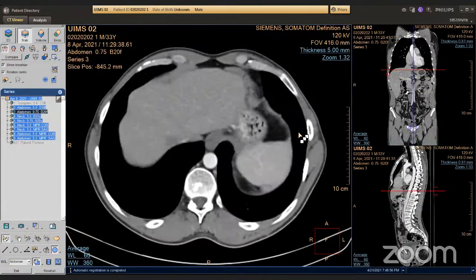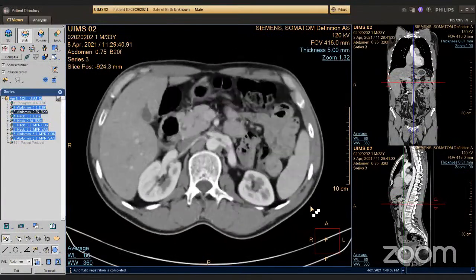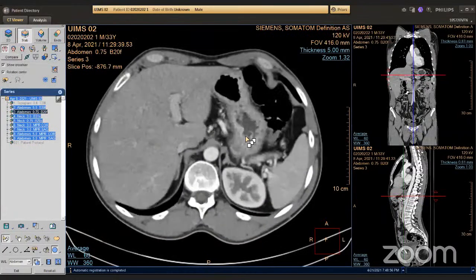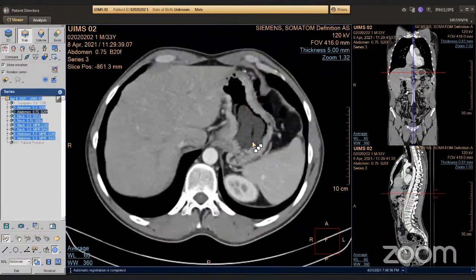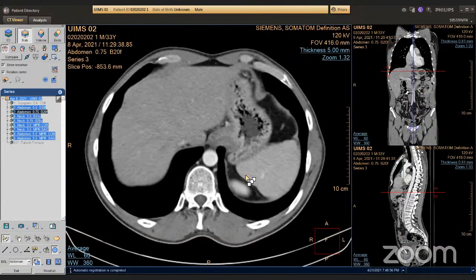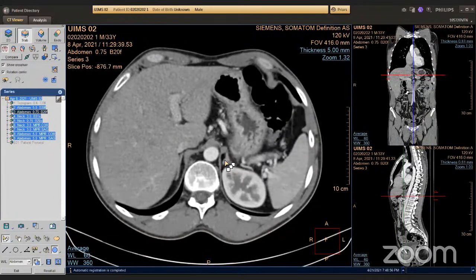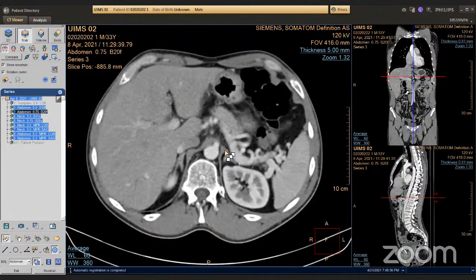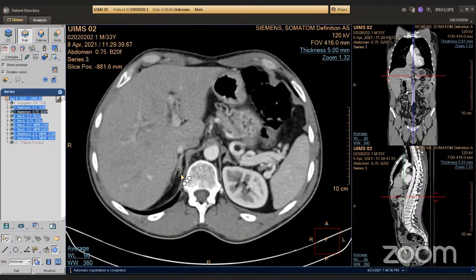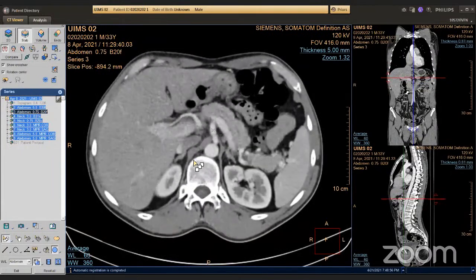This is the spleen. So I will check the spleen again. It's not enlarged and it seems homogeneous. No lesions there, no hypodensities. Suprarenal glands: I always think that they are sitting on the kidneys. They are more medial. This is the suprarenal gland on the left side, this triangular thing. So that's the normal left suprarenal gland, and the right one is here. So that's the suprarenal gland again, normal. Usually they can have some expansions.